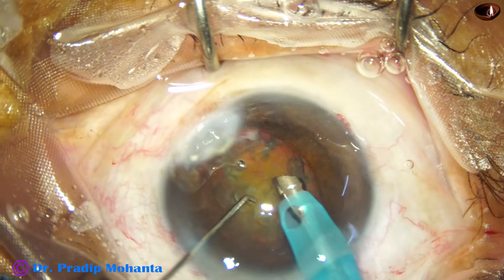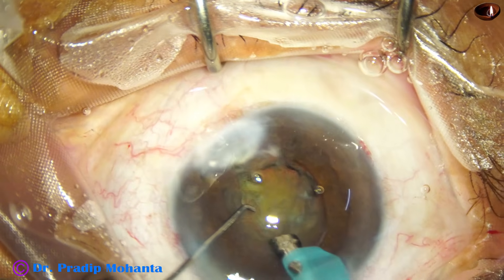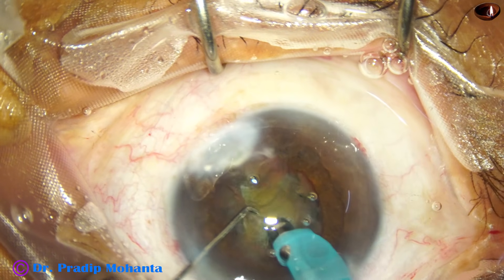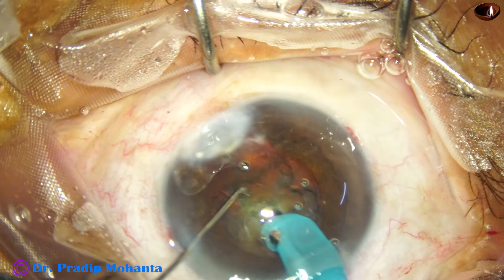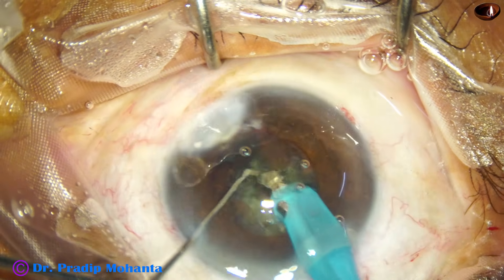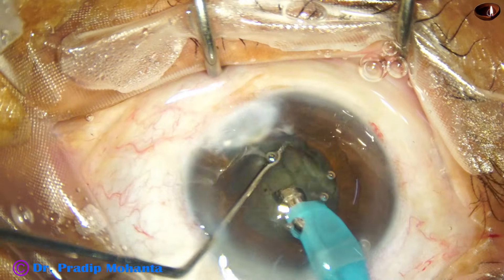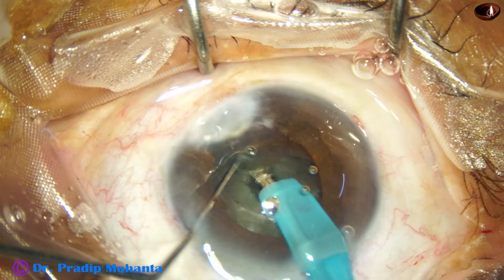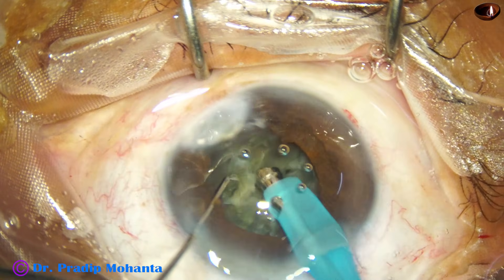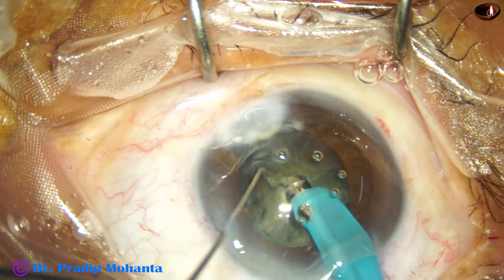Some superficial cortical lens matter is removed. Now the tip is buried in the substance of the nucleus, and with full ultrasonic energy it goes through the nucleus towards the opposite equator. The nucleus cracks just by the movement of the handpiece. The nucleus has been divided into two hemi-nuclei, and this hemi-nucleus is being subdivided.